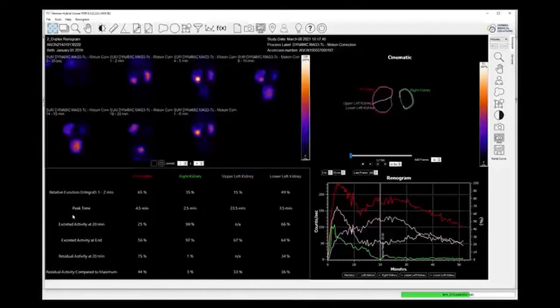But it's such a step forward in terms of functionality, and it's something we've needed for a long time, and it now just works so slickly.